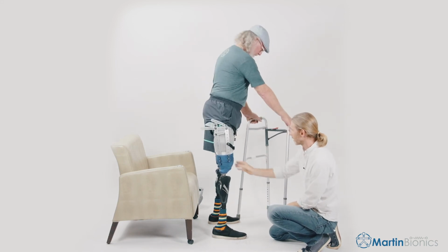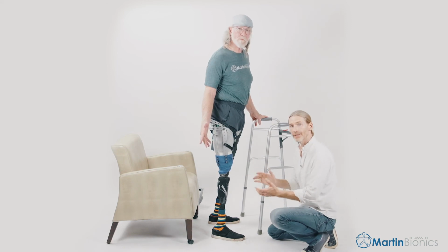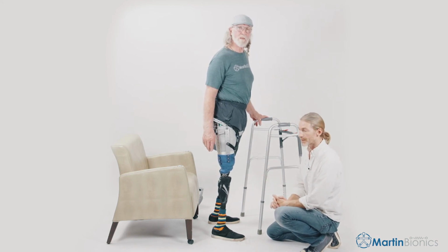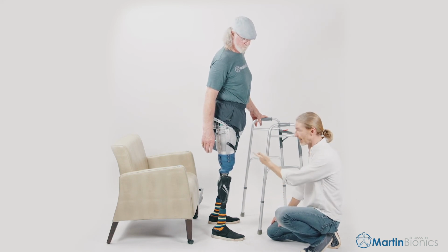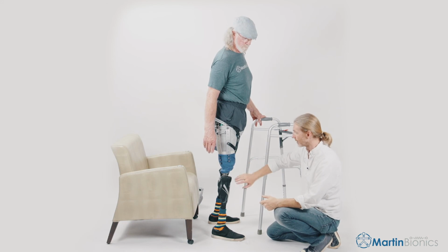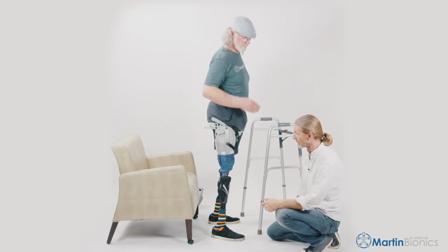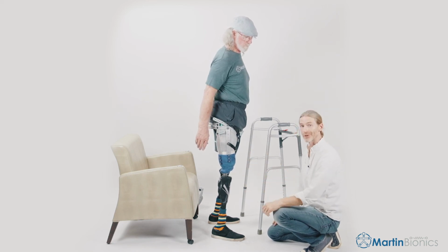And so we'll incorporate the pin lock and do some dynamic alignment next. But from the fitting process for the CX Hybrid, that's as fast as that. So we probably spent maybe an hour and a half in casting and setting up the CX Hybrid onto the cast section, gunking it onto the components and getting everything set up. And then our fitting process on average takes minutes.